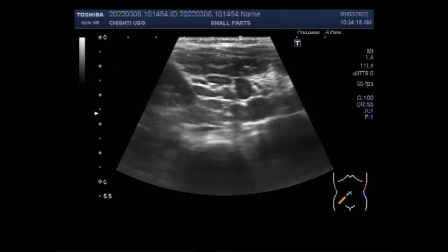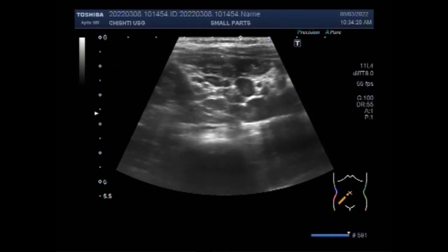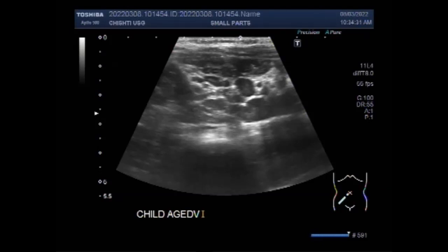Enlarged abdominal lymph nodes are frequently encountered in asymptomatic children and should not always be considered abnormal. Enlarged lymph nodes exceeding 10 mm in their shortest axis in children with abdominal pain may represent mesenteric lymphadenitis of various causes.